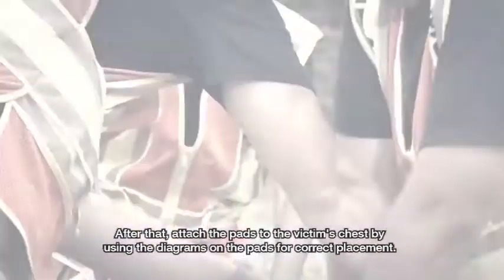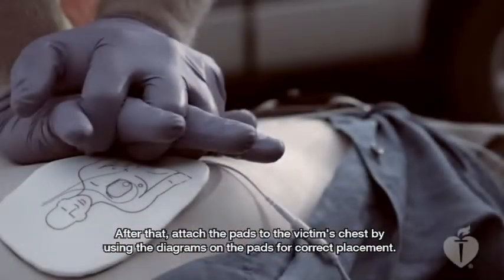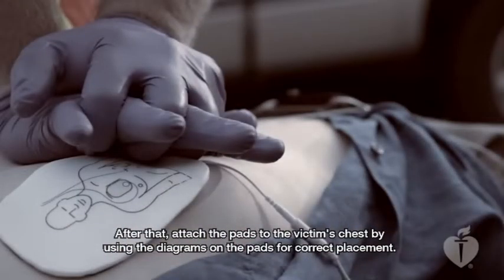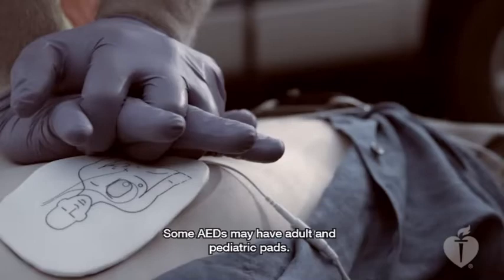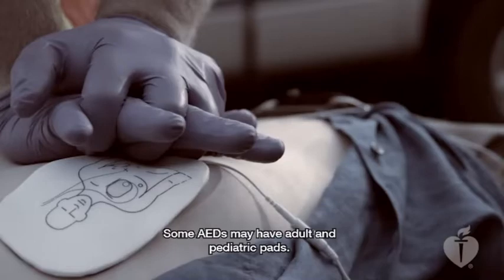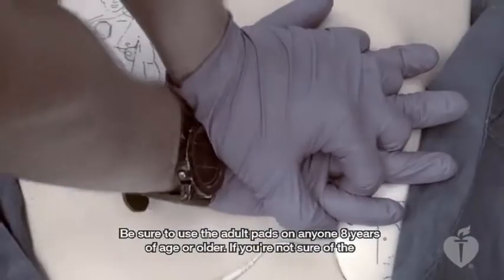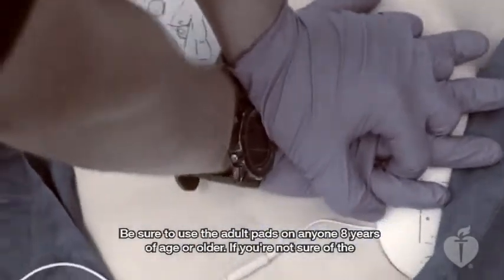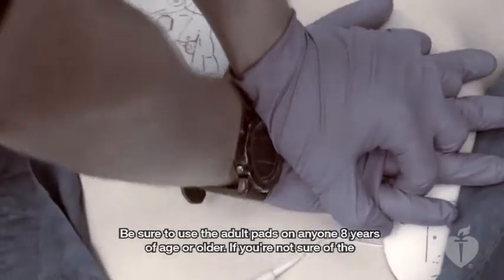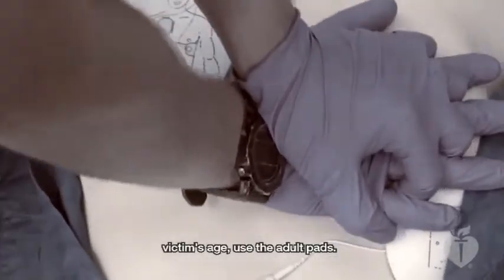Attach the pads to the victim's chest by using the diagrams on the pads for correct placement. Some AEDs may have adult and pediatric pads. Be sure to use the adult pads on anyone eight years of age or older. If you're not sure of the victim's age, use the adult pads.